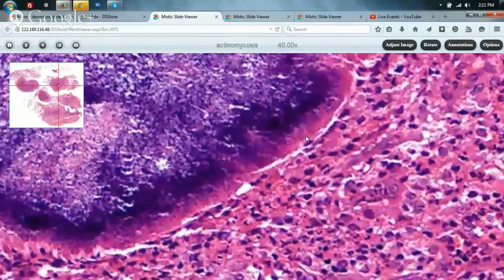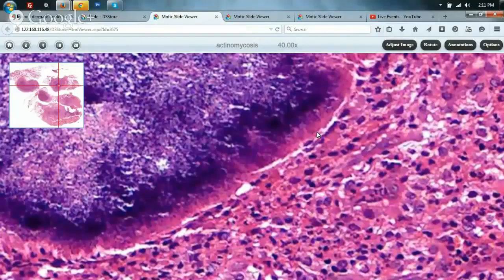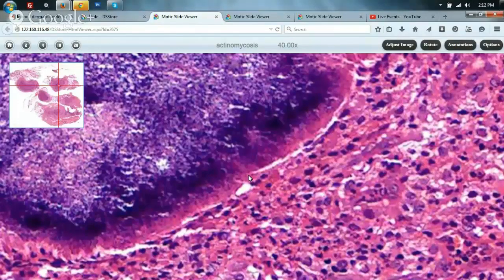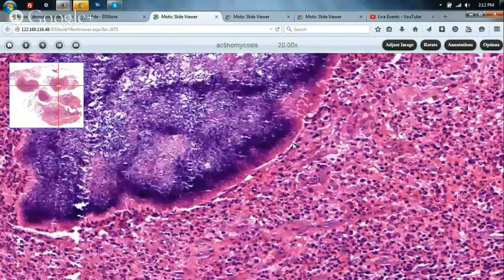It is important to differentiate actinomycetoma from eumycetoma because eumycetoma cannot be treated, whereas actinomycetoma offers every reason for hope. If culture is available, fine; but with reasonable experience a dermatopathologist can provide this answer based on filament thickness. Eumycetoma has much thicker filaments, whereas actinomycosis has thinner filaments — as in this classical example — so this patient is very likely suffering from actinomycosis and there is every reason to expect cure.